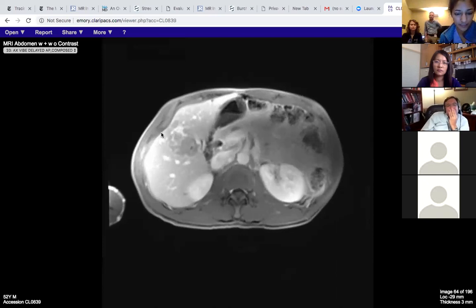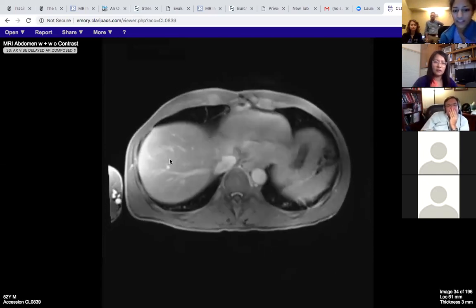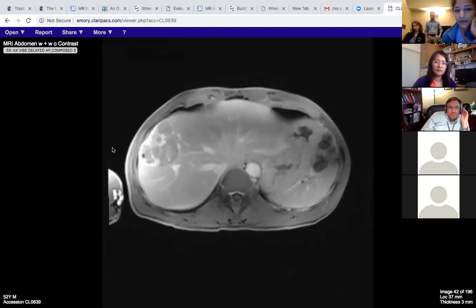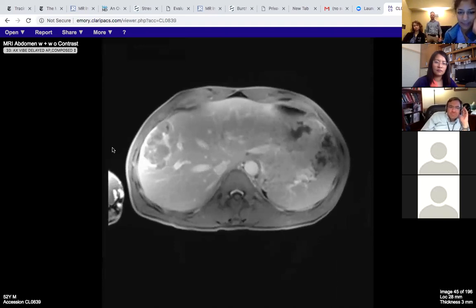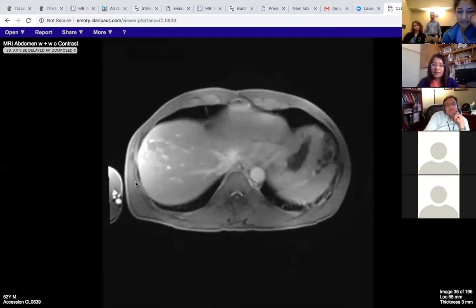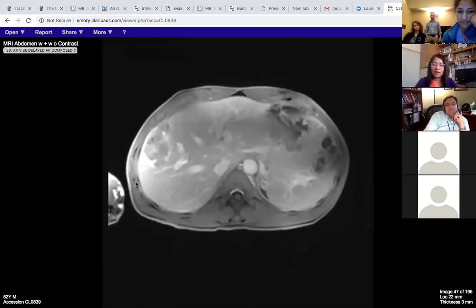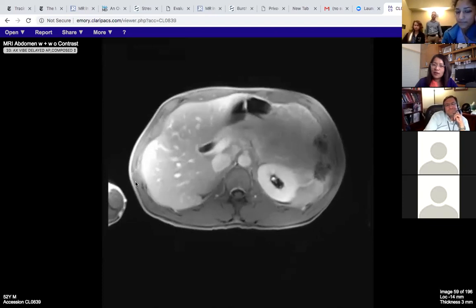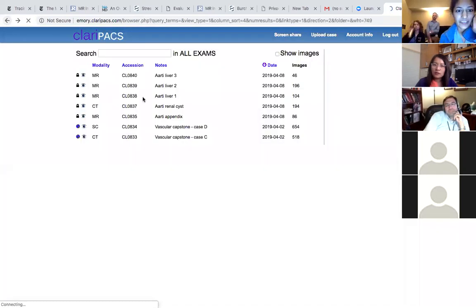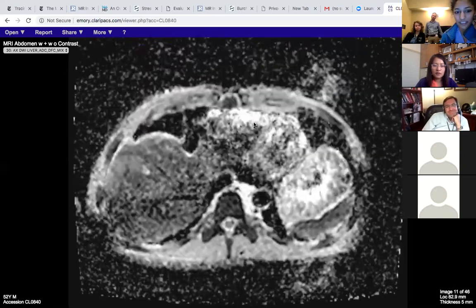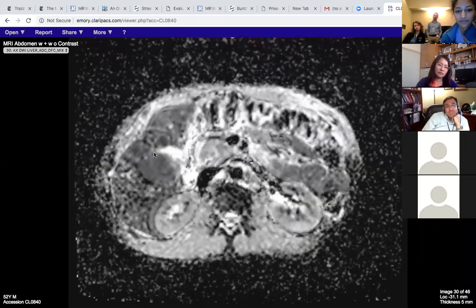Any thoughts about rapidly developing multiple masses in the liver? The patient has HIV. On T2 it was basically intermediate gray signal — not very bright. Someone suggests infection. But because it's enhancing and washing out, I'm thinking more about primary liver processes. It does restrict on DWI — that's actually a key feature of this case. In retrospect it had a lot of restricted diffusion, but was still pretty homogeneous.